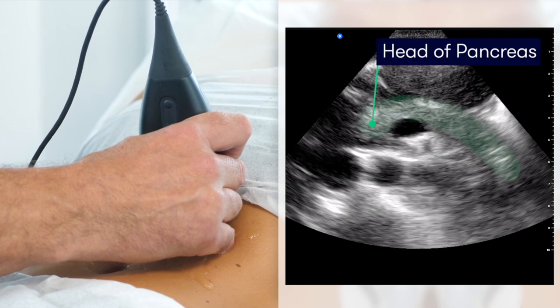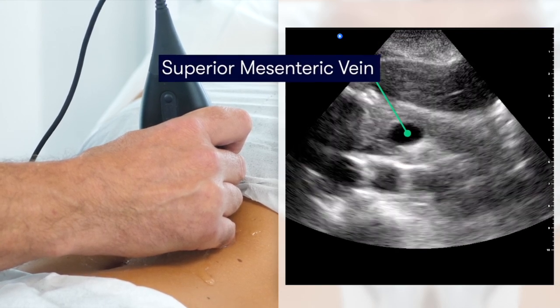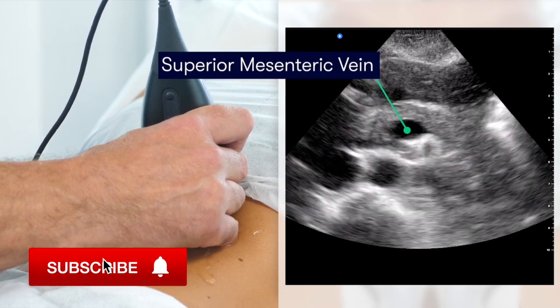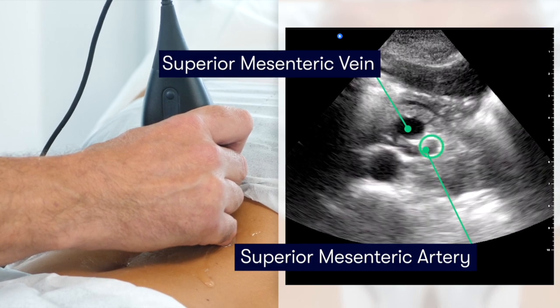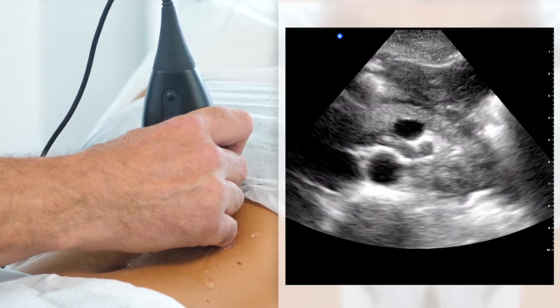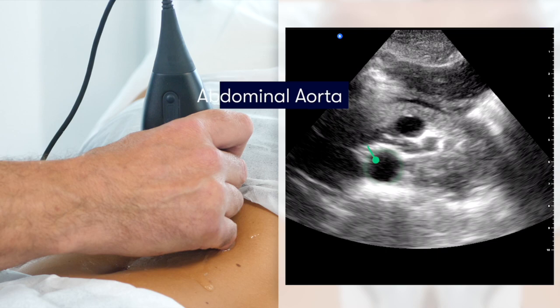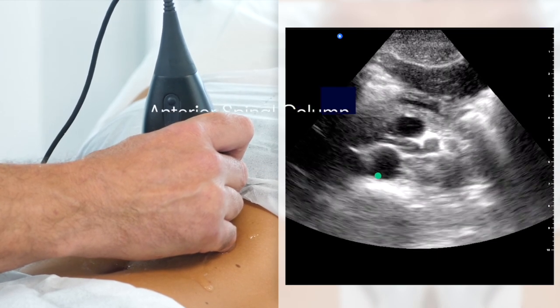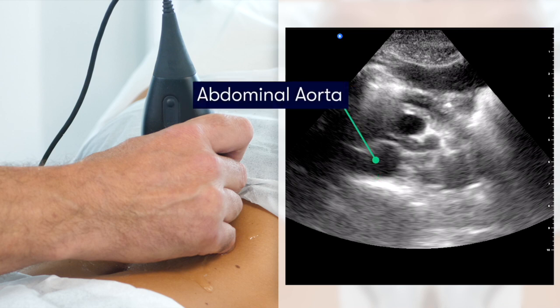Scanning a little bit more inferiorly, we come to the head of the pancreas, which is located where the splenic vein joins with the superior mesenteric vein. Continuing to scan more inferiorly, we can see in the middle of the screen the superior mesenteric vein, and just to the side is a small round structure which is the superior mesenteric artery. Deep to the artery, in the middle of the image, is the pulsating abdominal aorta. Even deeper, a bright horizontal line marks the anterior part of the vertebral column, showing just how posterior the abdominal aorta really is.